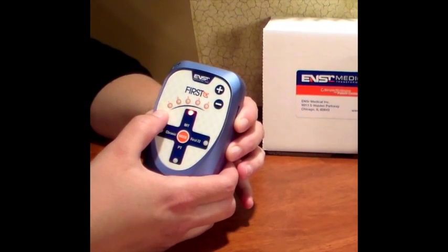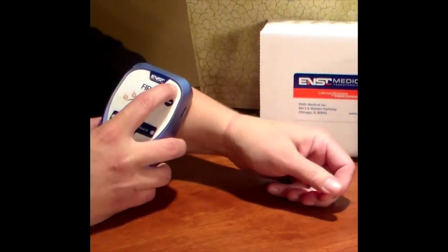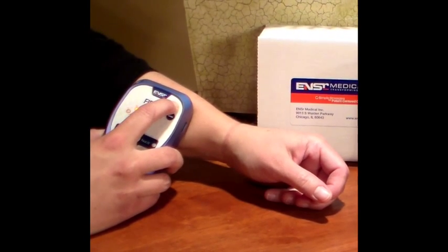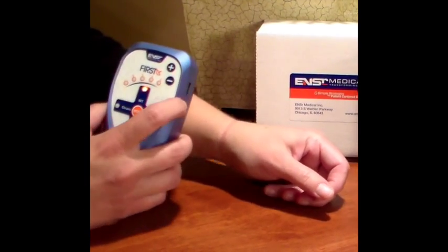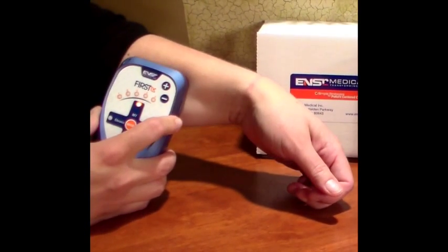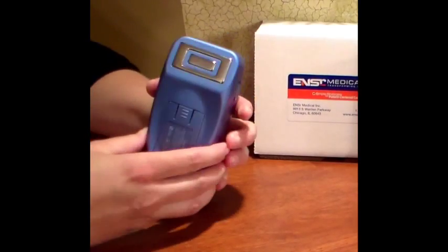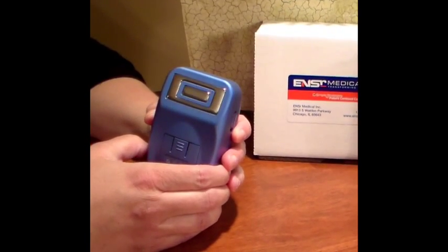The intensity indicator LEDs labeled one through five will tell us two things. First, they will show you the level of intensity as it increases using the plus and minus buttons. And second, they will help us locate the optimum place for treatment. The electrodes are located on the back side of the device and should always maintain contact with the skin during treatment.